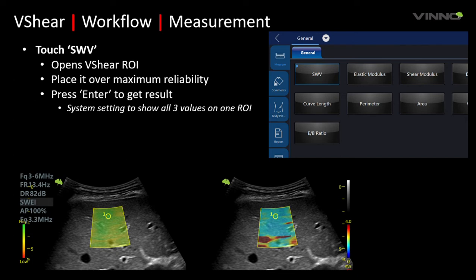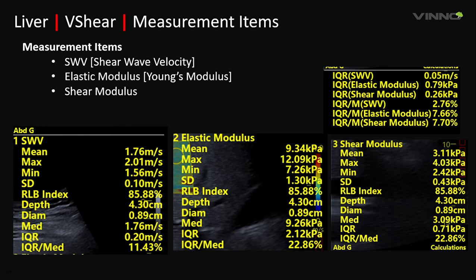Choose the measurement tab on the touch screen and touch the shear wave velocity measurement. A cursor opens — position it over the maximum reliability area and the system will display the measurement result. The system shows the shear wave velocity in meters per second, elastic modulus and shear wave modulus in kilopascals, and all statistics including maximum, minimum, standard deviation, mean, depth at which the ROI was placed, diameter of the measurement ROI, and the reliability index. Adapting to international guidelines, it shows the median value and the IQR/median ratio as per the SRU guidelines, which recommend obtaining three to five measurements with an IQR/median ratio less than 15% for shear wave velocity and less than 30% for elastic modulus.